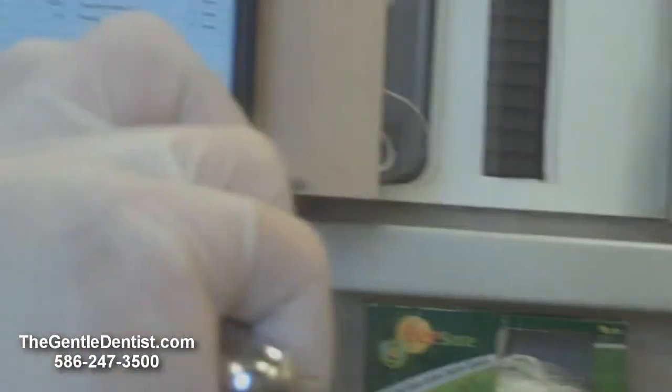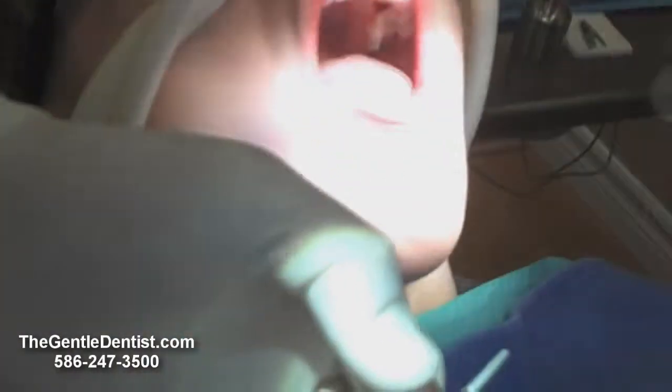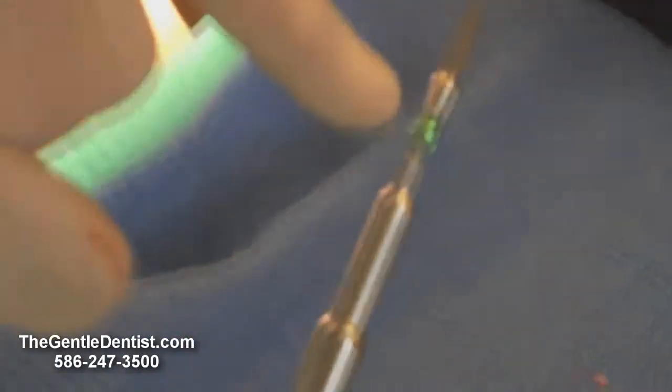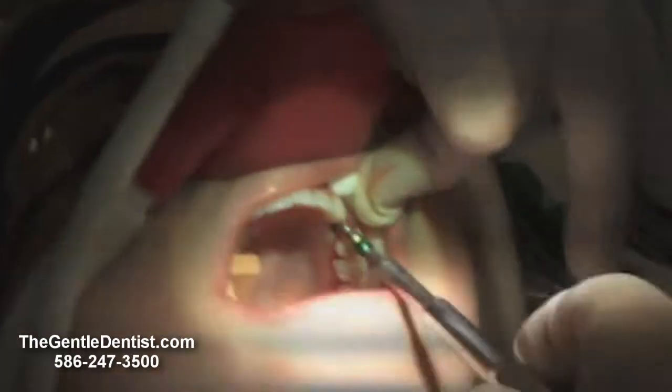This size comes on a little abutment piece that we can tighten up on, and this gives us the ability to hold it in place without affecting the titanium surface, which has been completely sterile as we place it into the bone. Now we're putting it into a driver, almost like a screwdriver, and I'm going to place it in with some pressure and a lot of accuracy. We're just torquing it in place right now, little by little.